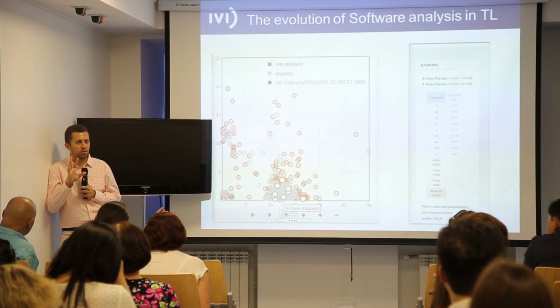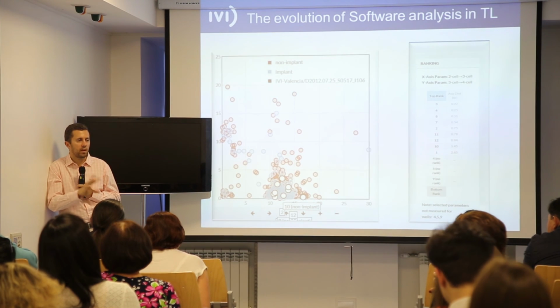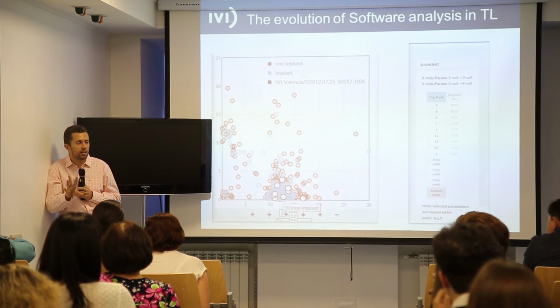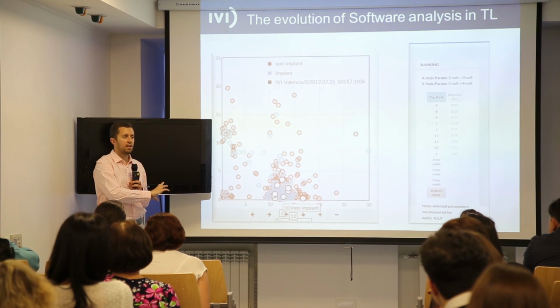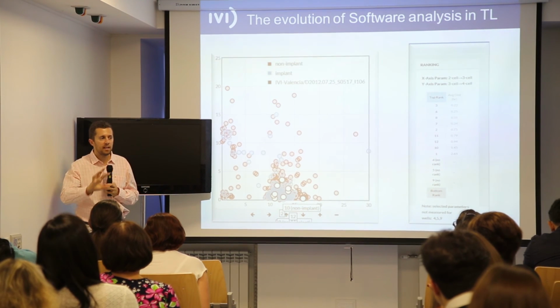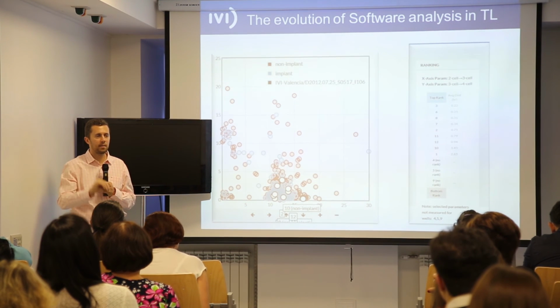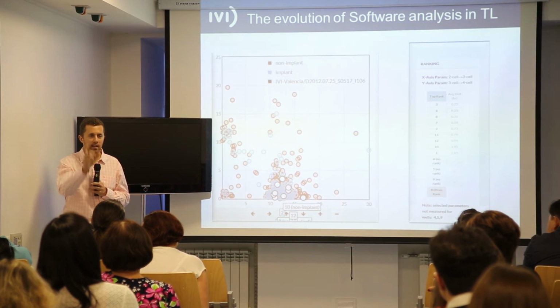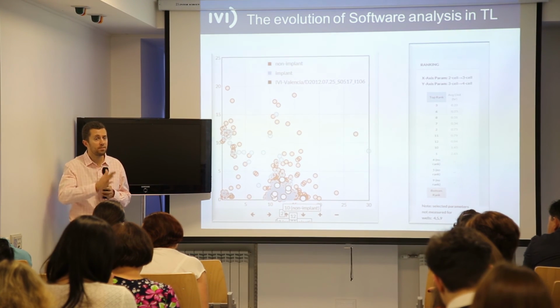This is very important because those that are users of time-lapse and believe that the algorithm that we have created does not work in your clinic because you have different culture conditions or whatever, you can have access to such a kind of software in which immediately after doing the evaluation of the embryos, you upload in the system and the machine automatically is giving you a ranking of the embryos that will help you to select the best one. So maybe the future is in that way.